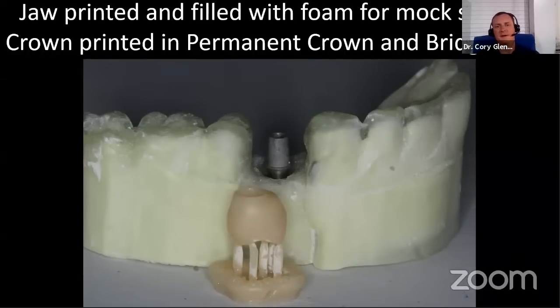Now, this is the first time we'd ever tried something like this, so I thought it'd be wise to go ahead and try it on models first in theory and make sure it all worked. So this is just a model filled with foam that I could drill on. I did the guided surgery on it. I placed the implant. Now I'm putting on that tie-base.